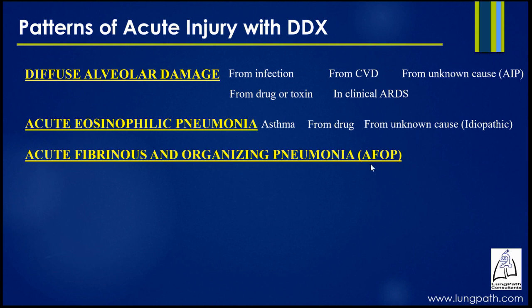You don't diagnose AFOP, you describe the features, and this can occur as a completely idiopathic condition.